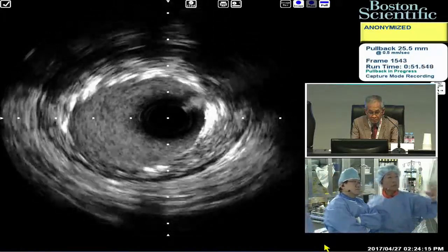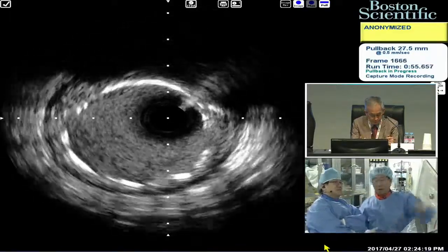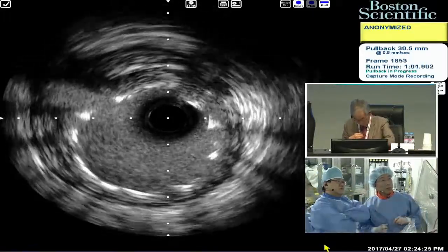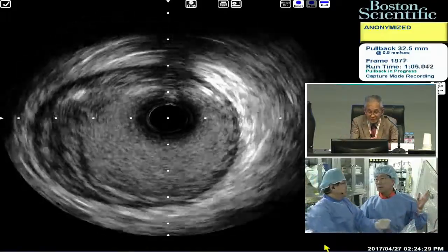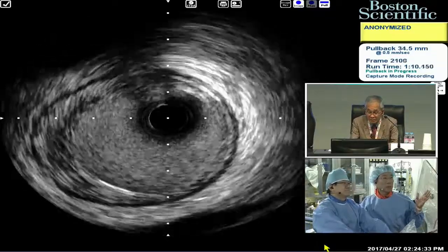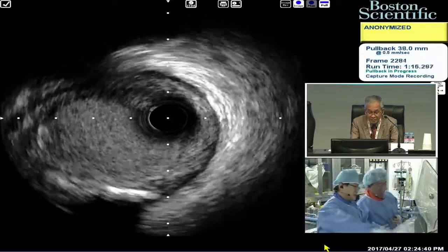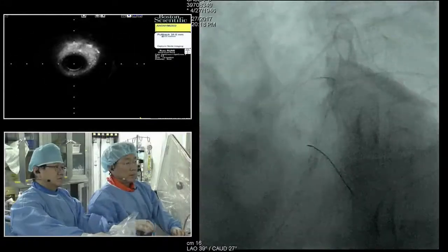We used the 3.5 stent. However, minimal stent area is almost 4, right? We're going to do the 3.8 something. Well apposed stent to the lesion, 1 or 2. I think it's almost perfect, right? So we don't need any more dilation for the LAD part. However, we're going to try the wire to the diagonal branches.